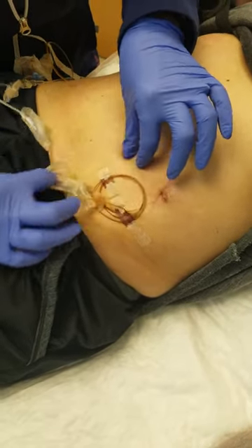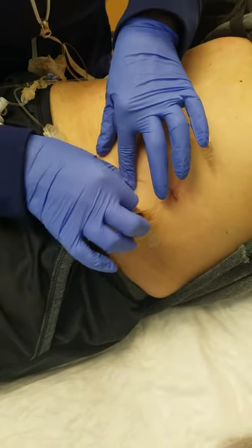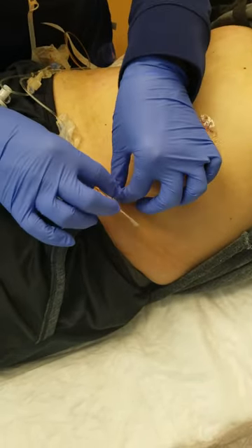This is two days post-operatively, so the pumps will last about two days. Now I've got all the tape out, and now I'm going to pull it out.